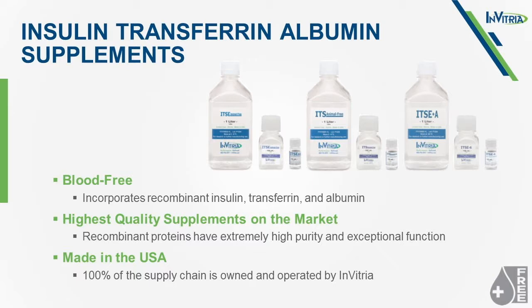So these formulations also contain sodium selenite, which is an extremely powerful antioxidant that's currently incorporated into most serum-free media formulations. There are a couple of differences between these products that are worth mentioning. The ITSE product, in addition to having insulin, transferrin, and selenium, also contains ethanolamine, which is an important lipid precursor that's required for some cell types, but not for others. The ITS product, again, contains only insulin, transferrin, and selenium.